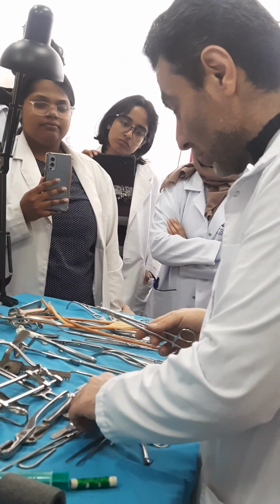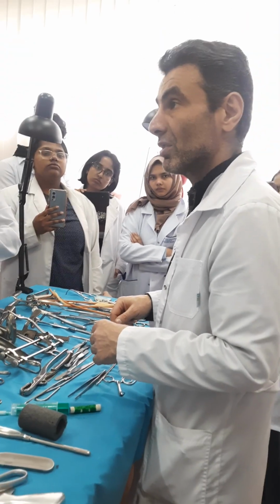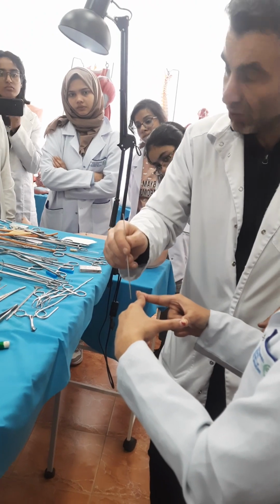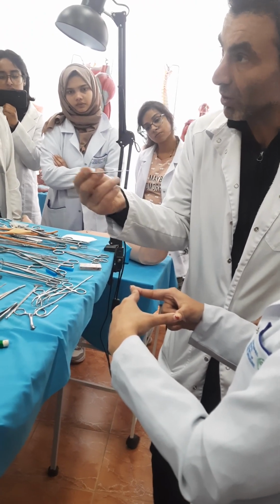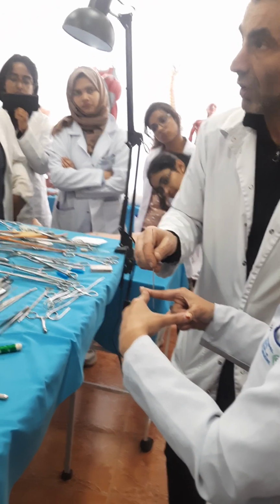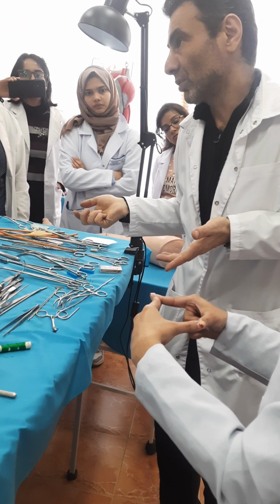But in that case, you can ask me why we need straight needles for superficial manipulations. Again, hold your finger. For example, when you make the sutures, what is visible afterwards, like the scar? Not only the suture line, but piercing points. You see one line and points. And exactly, it's not beautiful.